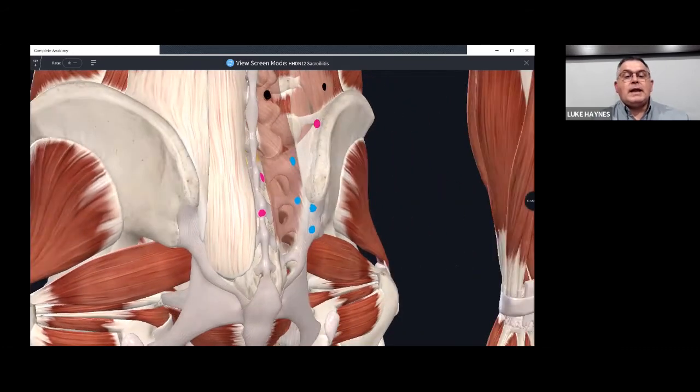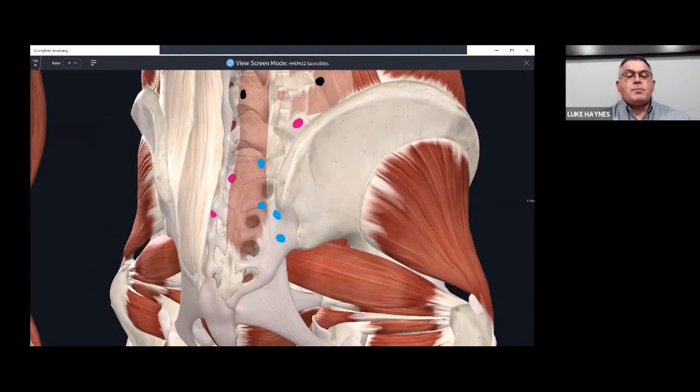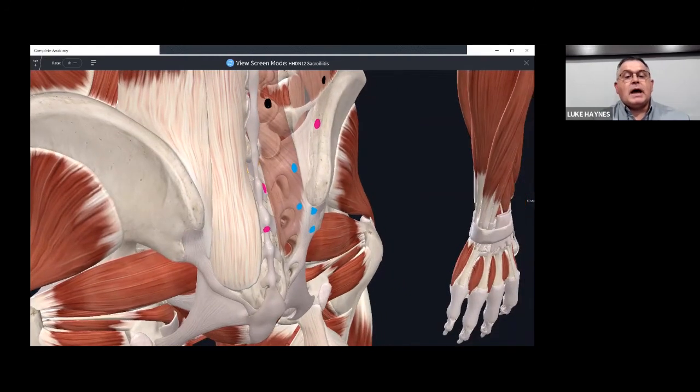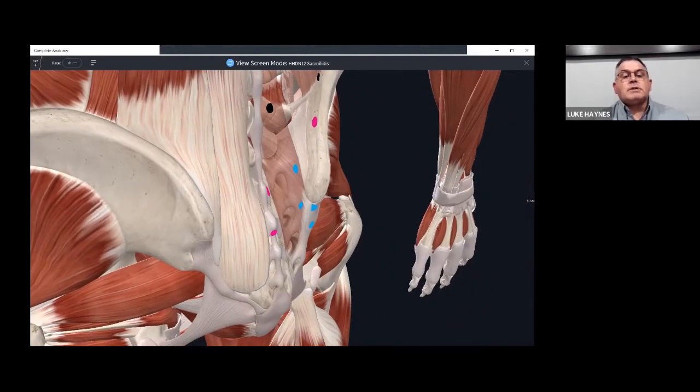For the deep sacroiliac ligaments, we're going to be medial to the PSIS, and then at S1, we're going to needle superior and inferior, and we're going to angle those needles. The superior, we're going to angle inferior. The inferior needle, we're going to angle superior, and we're going to try to get them to meet at the depth of the junction between the ilium and the sacrum, deep in there.